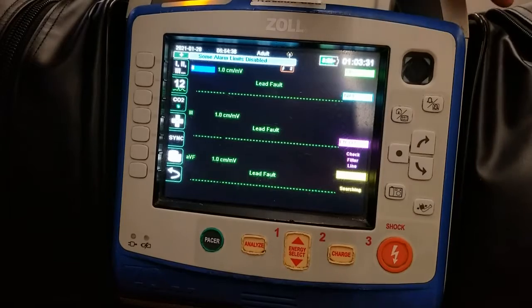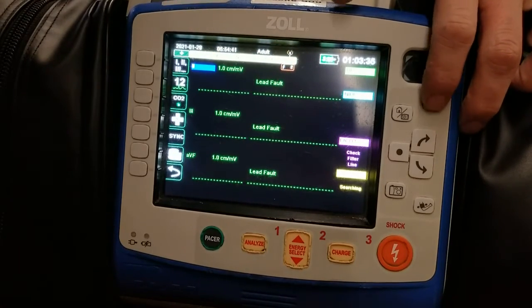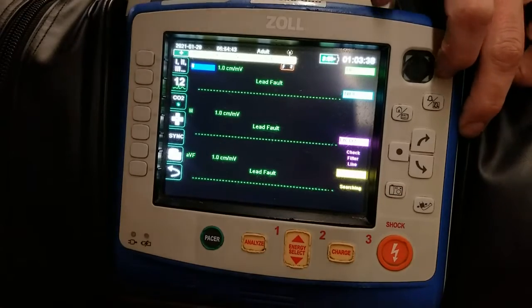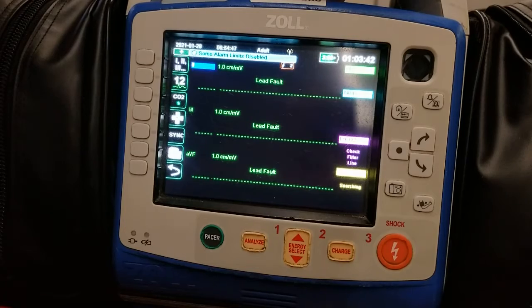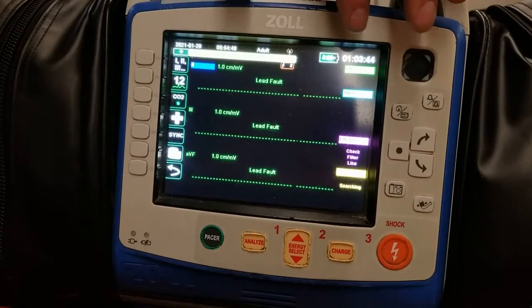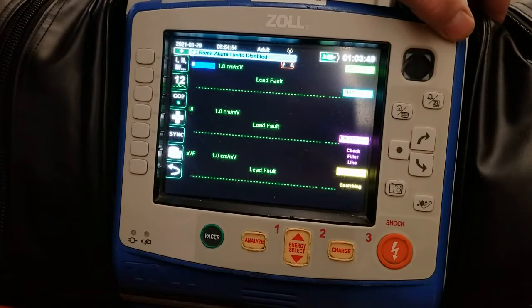All right, now we're going to be monitoring the patient's heart rate. We can silence the alarm up here in the upper right-hand corner. Click that once for a 90-second silence. We would have a 4-lead already attached to the patient, likely a 12-lead at this point, so we would be having data come across here. But in this case, we've determined that the patient's unstable and that we're going to need to start pacing him.